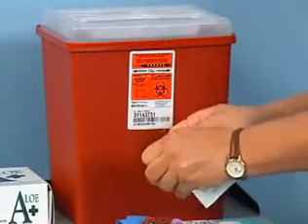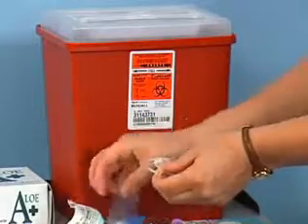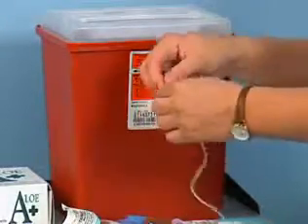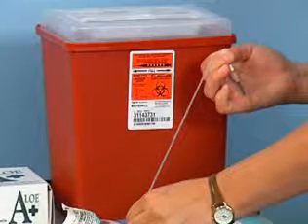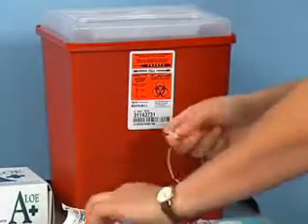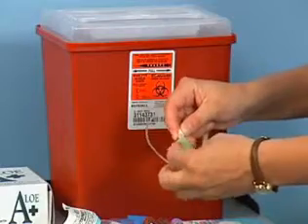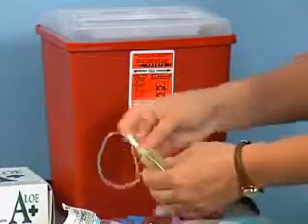Next, you must prepare the winged infusion set. Remove it from its package and extend the tubing to its full length. Stretch the tubing slightly to prevent it from coiling back up. This permits a free flow of blood in the tubing. Insert the posterior needle into the small opening on the plastic holder. Screw the plastic holder onto the luer adapter and tighten it securely.